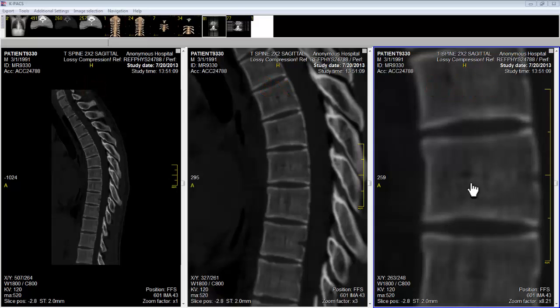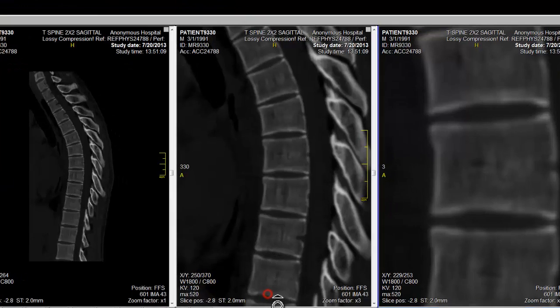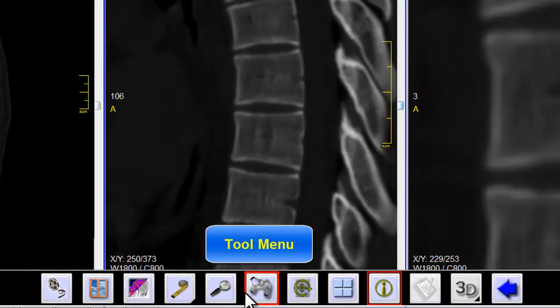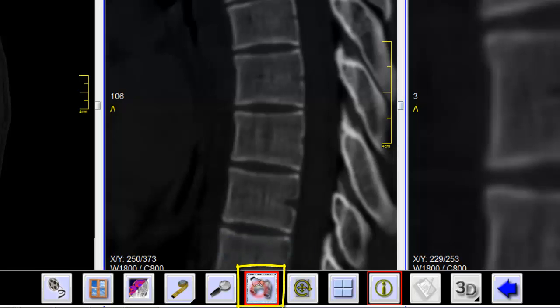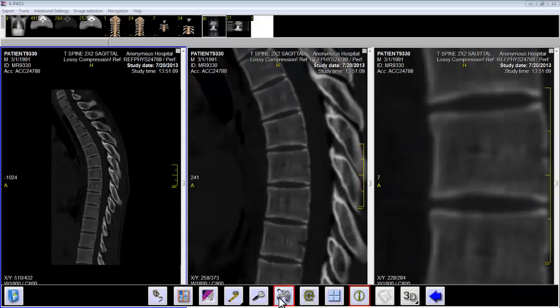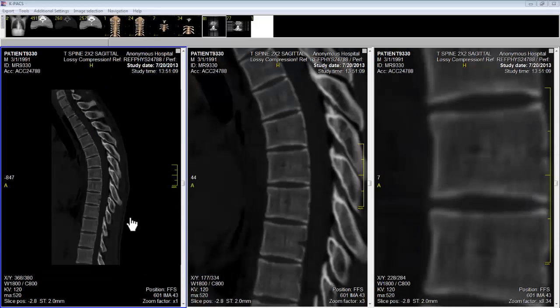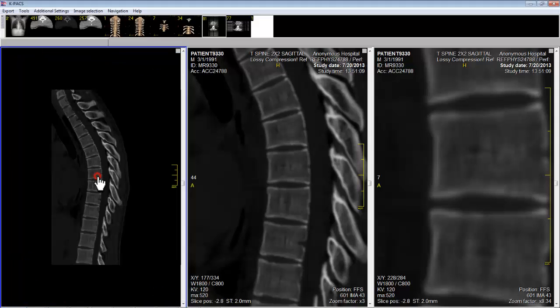To change the zoom factor, I move my cursor to the bottom of the screen until the tool menu appears. Then I left click over the move zoom icon. Then I'll move my cursor to the image that I want to enlarge, which will be our left hand panel. I'll activate that particular panel by left clicking.